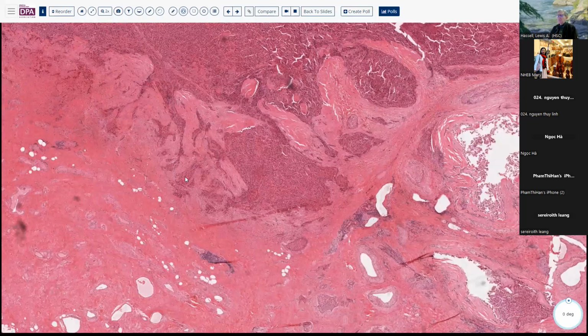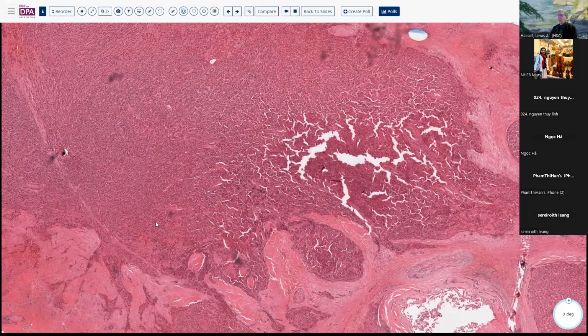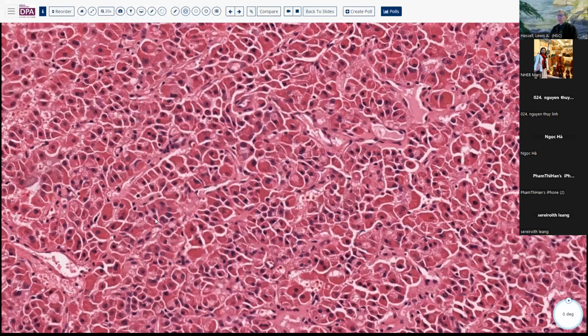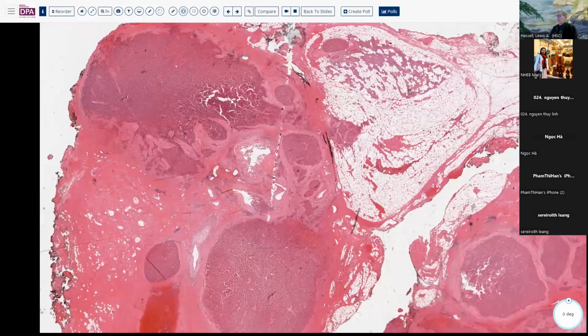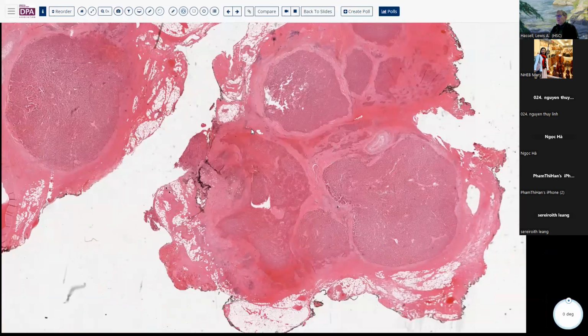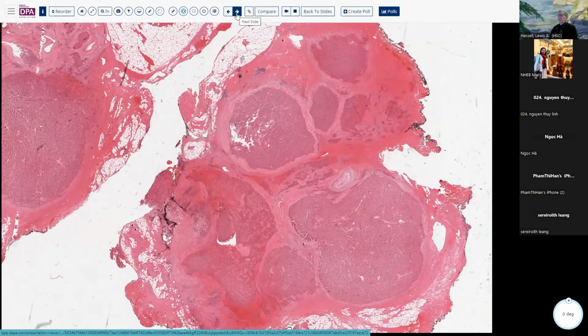So no problem in defining this as malignant, unless you're just dealing with the cytology, in which case this might be very difficult to classify as malignant based just on the cytology. And that's one of the reasons why, when we see a Hürthle cell neoplasm, we generally recommend that they consider excision, because this pattern is a little bit more common with Hürthle cells than with just cellular follicular adenomas.